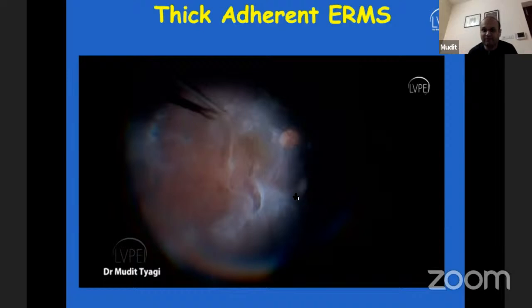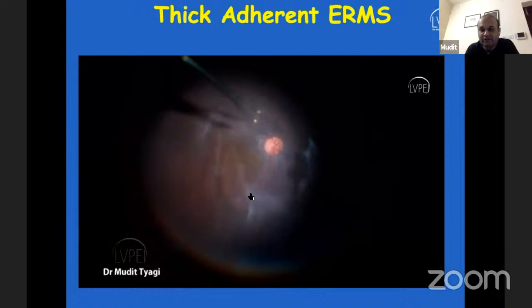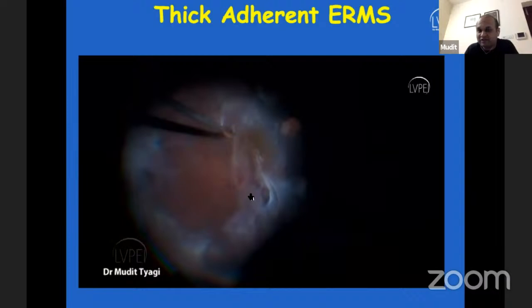Because then post-operatively, when you see an OCT, you will see the retina is flattened, but a shallow layer of fluid is still present underneath. And that is because this taut membrane is not allowing the retina to settle back. So you have to carefully remove this. See how adherent it is. And you have to very carefully remove it. Sometimes if you're not able to remove it, you might just truncate it with a cutter. And that's where the 25 gauge or 27 gauge cutters, because they are so thin, let you easily go underneath these membranes and just remove them.